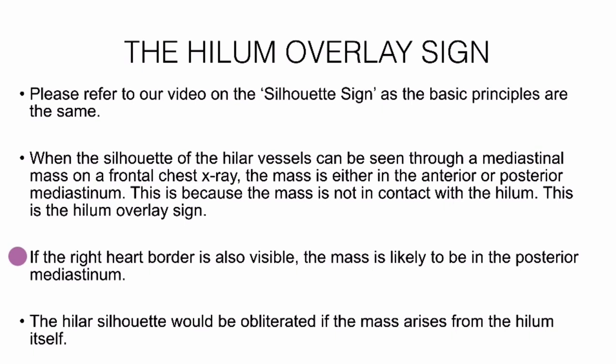If the right heart border is also visible in addition to this, the mass is likely to be in the posterior mediastinum. The hilar silhouette would be obliterated if the mass arises from the hilum itself.